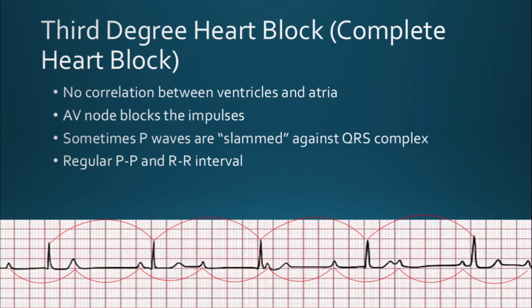One sign you might notice is a P wave slammed right against a QRS complex — that P wave is not far enough away to have conducted that QRS. You might also notice that the first T wave looks different from the others; the P wave gives it a more pointed appearance.